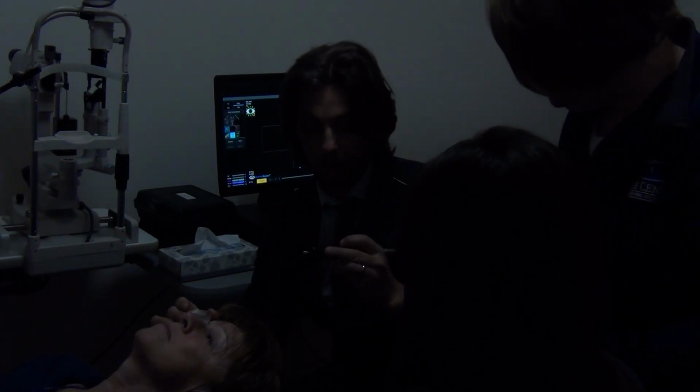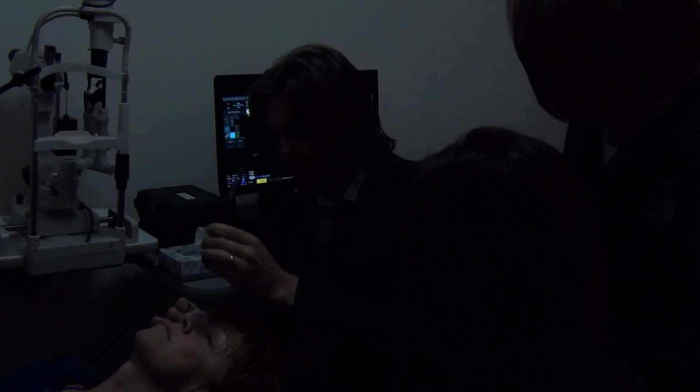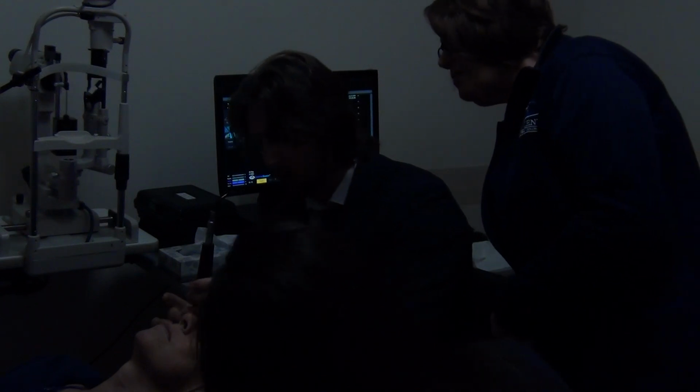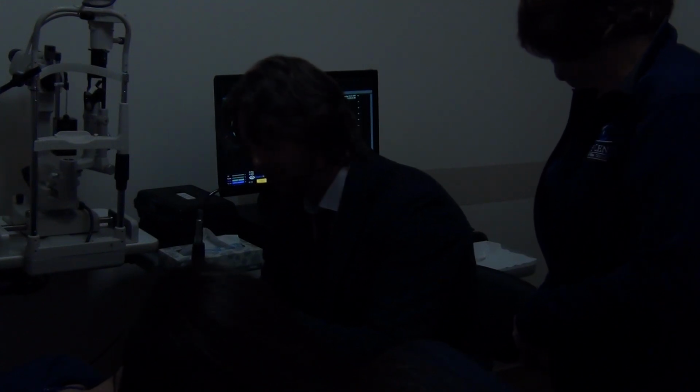This little metal port is your nasal marker at this point. So we immerse the probe in the shell. Again, if I take it as close, you see I rest my fingers on it. Now look at the image. I know I need to go a little deeper. Beautiful. And you see all the parameters are building up automatically.